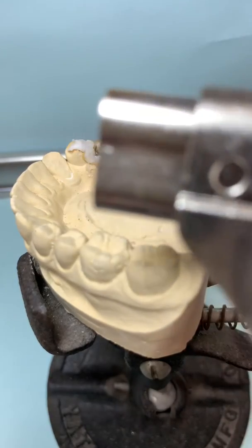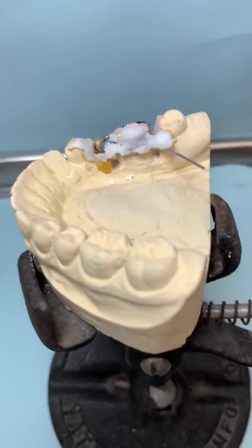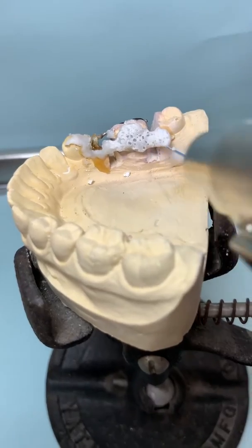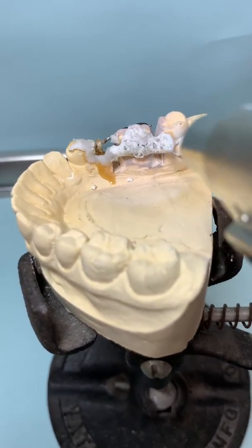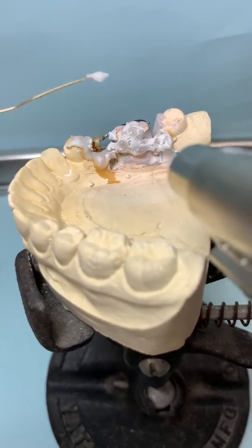We're going to use a regular butane type torch for soldering. Turn the butane torch on. Our first step is to heat up the flux — it's going to start to turn clear. Once it starts turning clear, we start adding the silver solder.